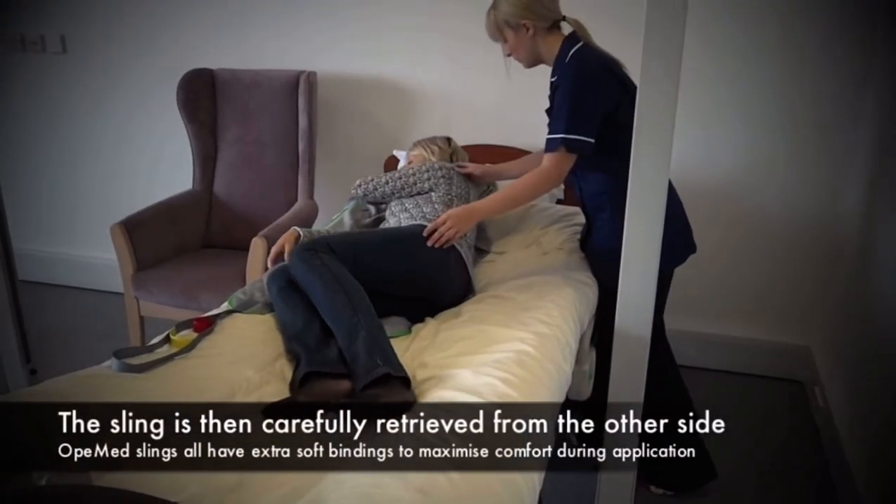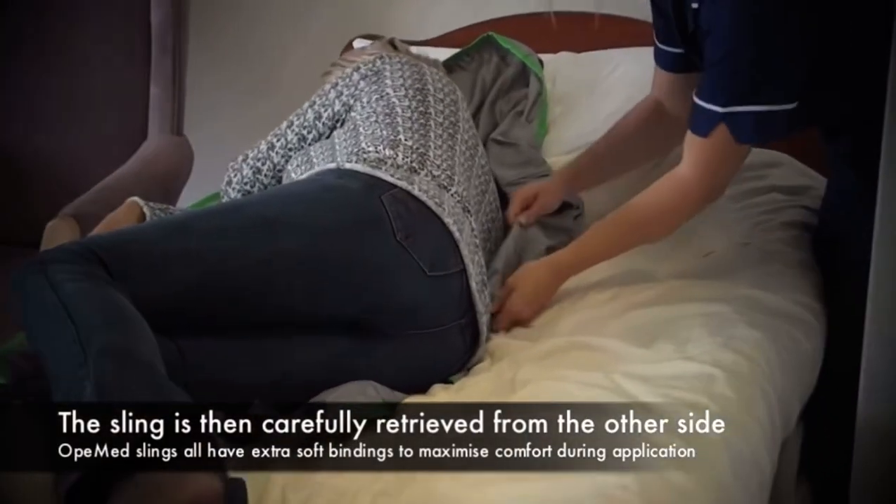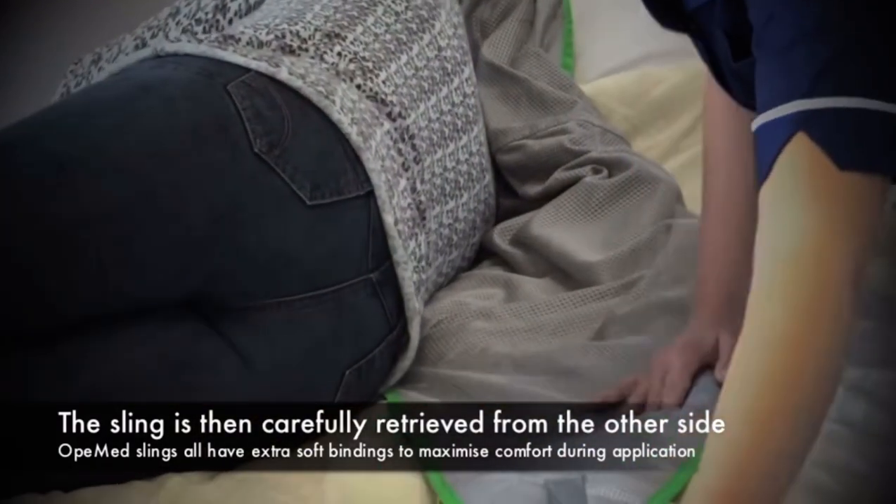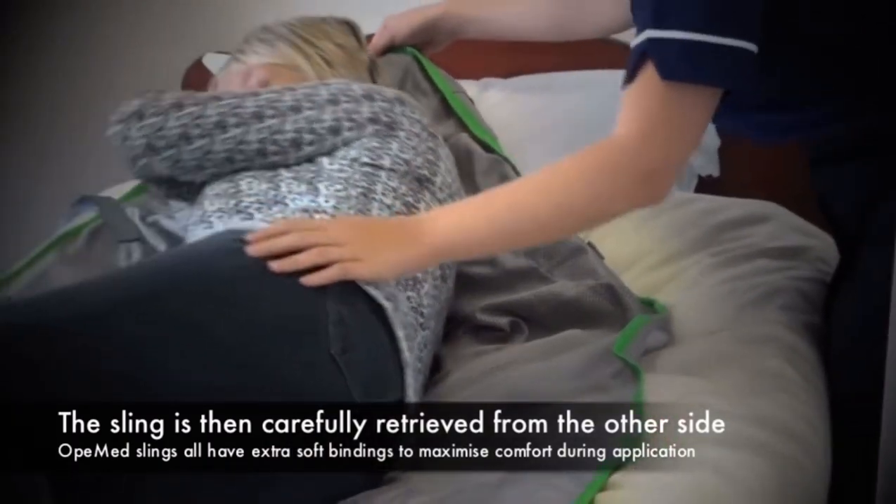The client is then rolled over and the sling pulled out, ready to introduce the legs.